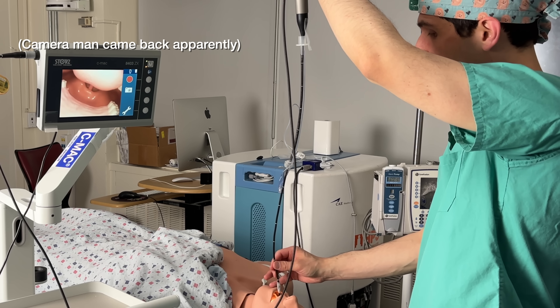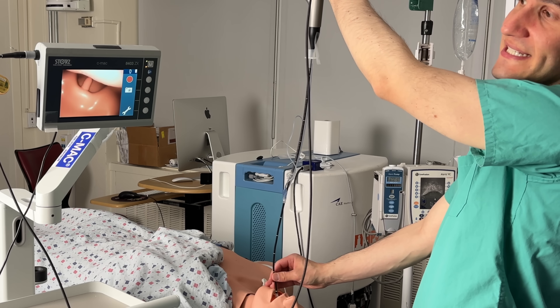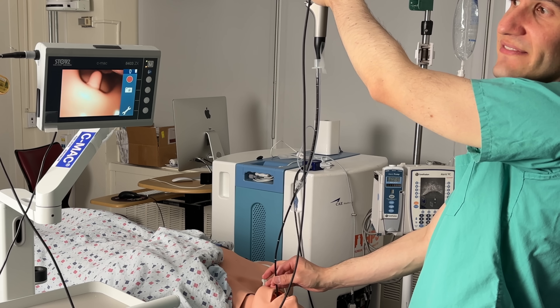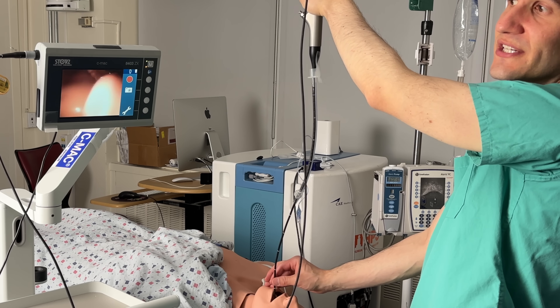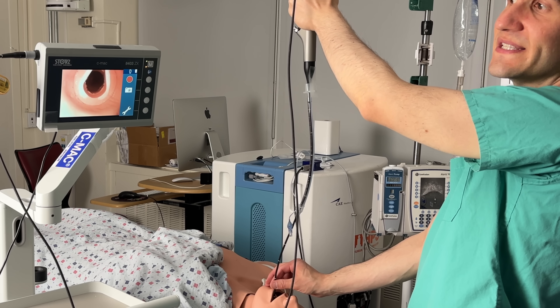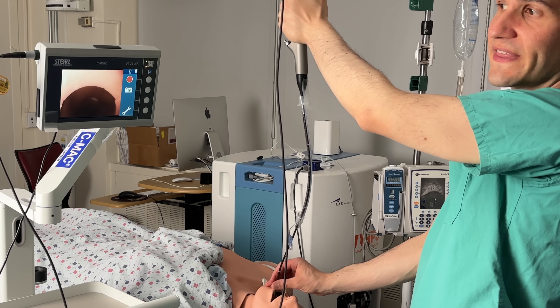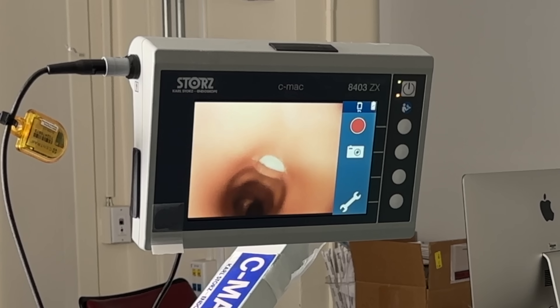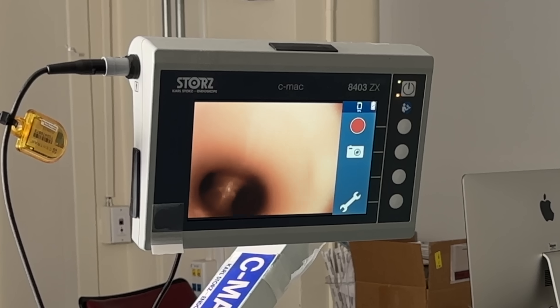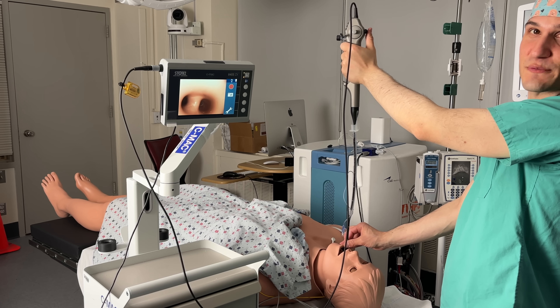As I'm first getting started, I actually watch the tip of the scope go into the back of the patient's mouth until I can no longer see it. At that point, I take a look at the screen and try to navigate very gently to stay off of any structures that could cause the patient to cough. I'm looking for the vocal cords — and this is the perfect view. I'll go ahead and try to pass the tip of the scope through the vocal cords without actually touching them or any surrounding structures. Now that I'm past the vocal cords and I'm inside the trachea, I try to stay off the walls of the trachea and make my way down the middle until I can see the bifurcation of the right and left main stem bronchi. This is the carina — this is the exact spot where I want to be.